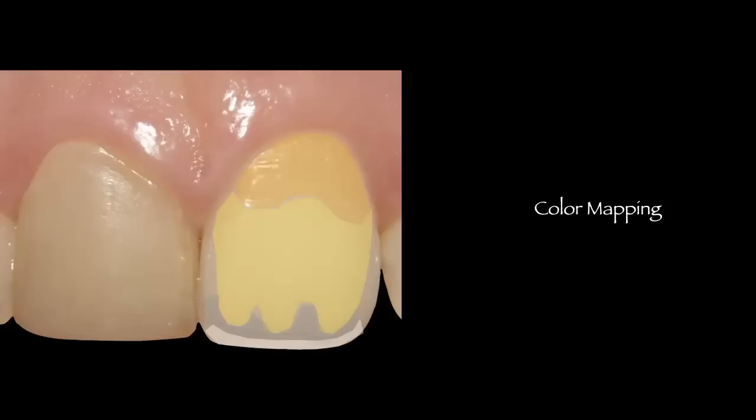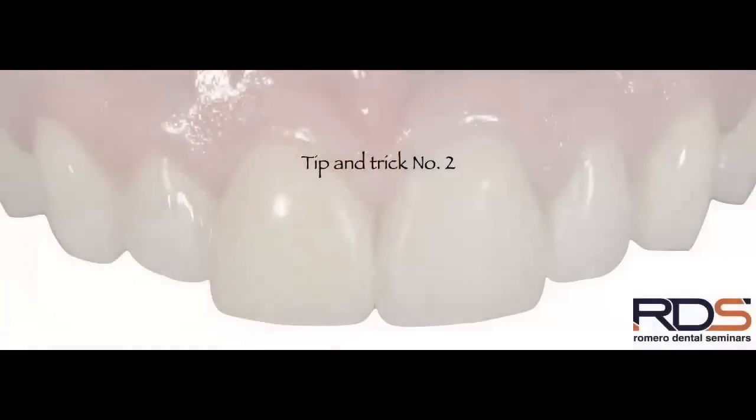And finally, I'm going to add that little white opaque line at the incisal third to recreate the halo that the patient presented with. So again, what the color mapping does for you is just helps you identify these areas of greater or lesser saturation, the areas of translucency, the areas of white opacity. So that will help you map and strategize your resin composite layering technique, because now you understand that layering is all about combining these different shades so that you can achieve an ideal final result. And I'll walk you through that process.